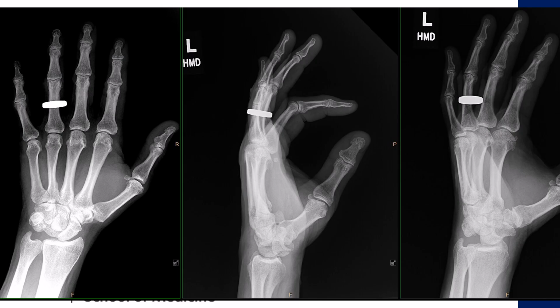Here are his x-rays in the emergency department. These are 3 views of his left hand demonstrating a Mayfield 4 lunate dislocation. You can see here, most notably in the AP and lateral views, the disruption of Gilula's lines, and you can see the lunate flexed and dislocated out of the radiocarpal joint and really into the carpal tunnel here.